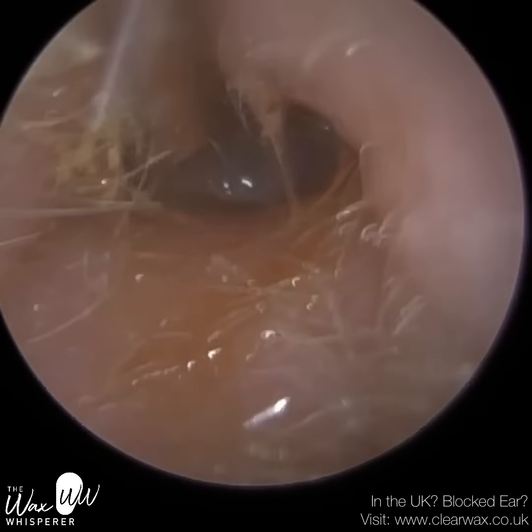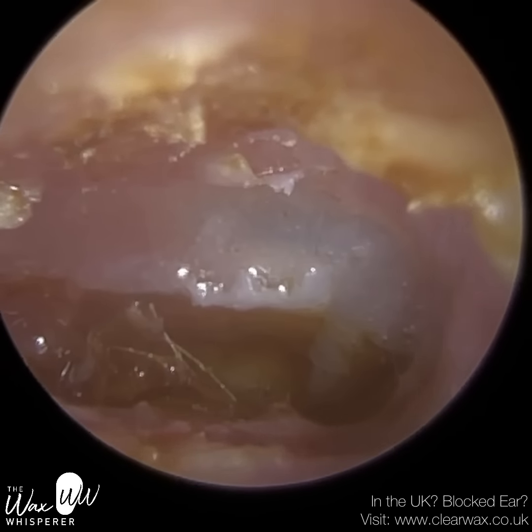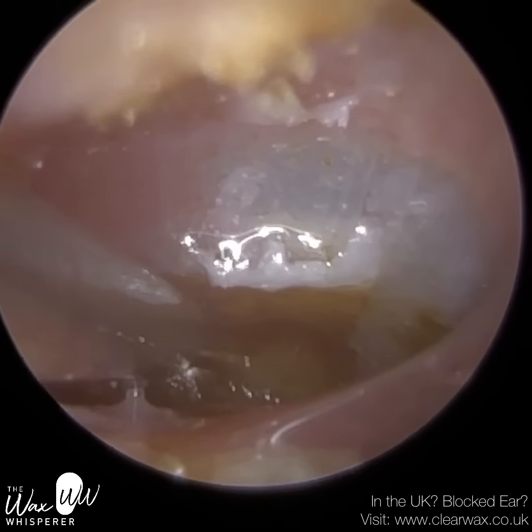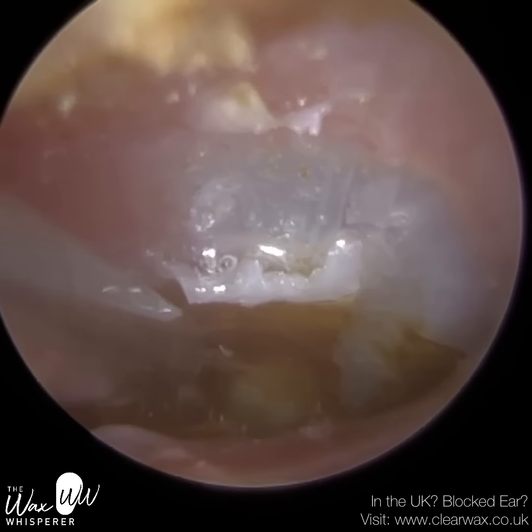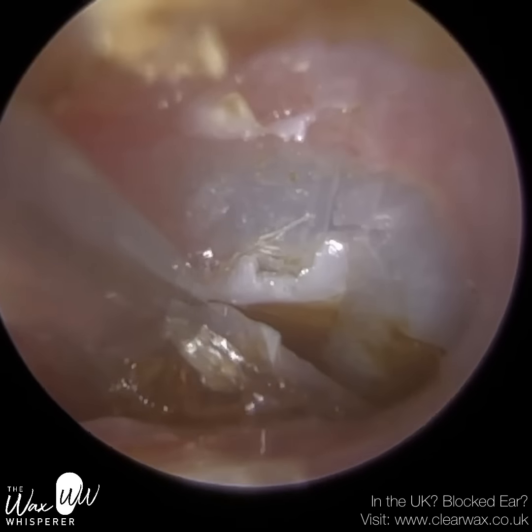We don't want to perforate the patient's eardrum. And I want to remove the skin because it's not going to come out by itself and you're going to get another layer. So this oil will just help soften it. And I believe you're going to say there are 2 dead skin layers here. So this is the first one that I'm removing. And I'm just in the anterior recess. I'm just using a fine end suction probe.